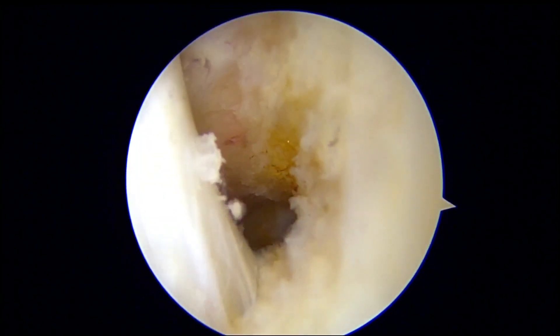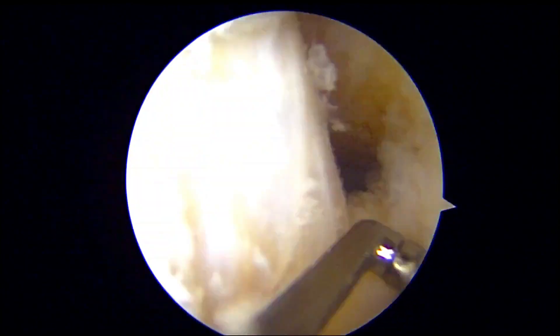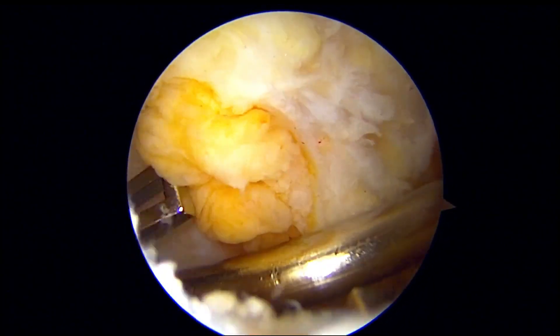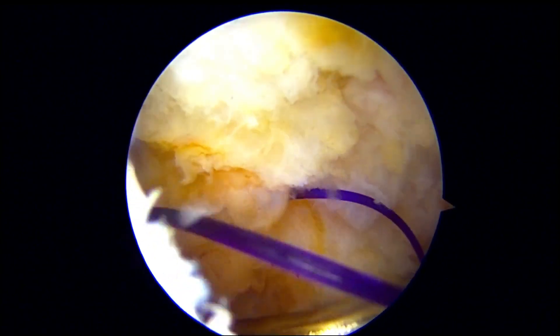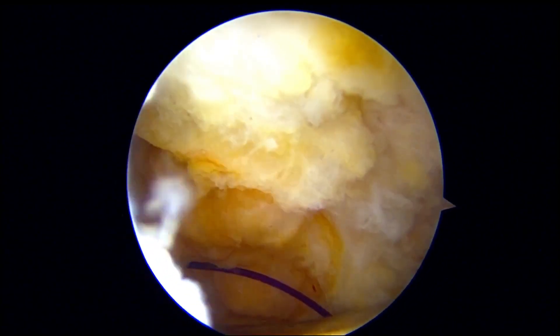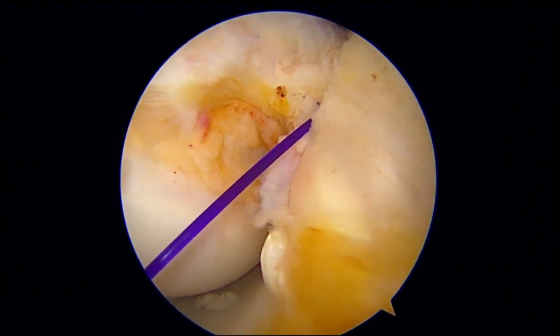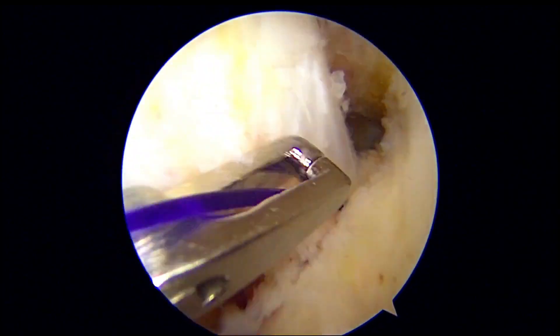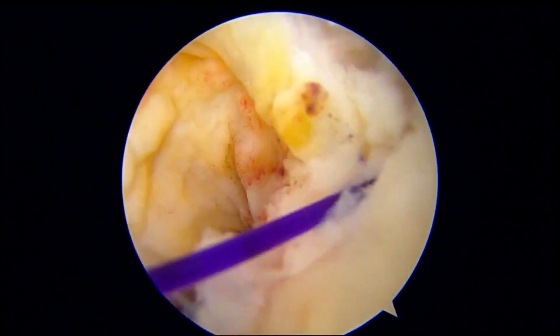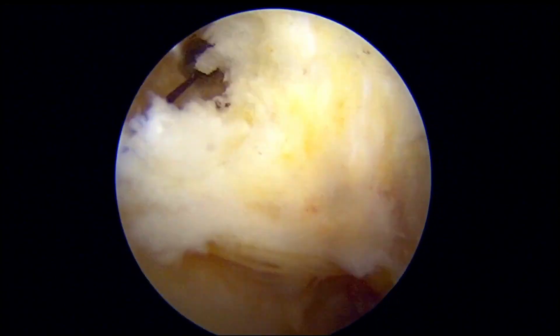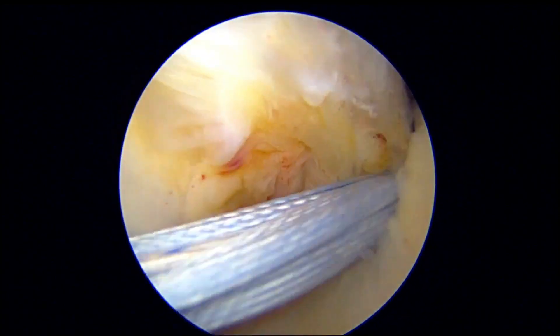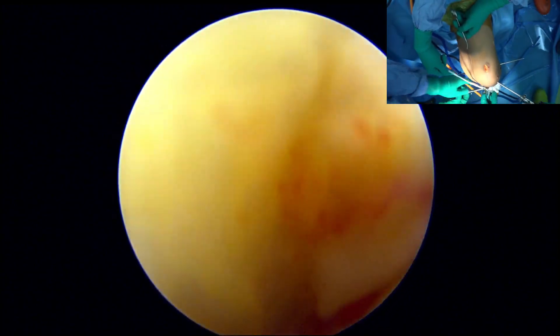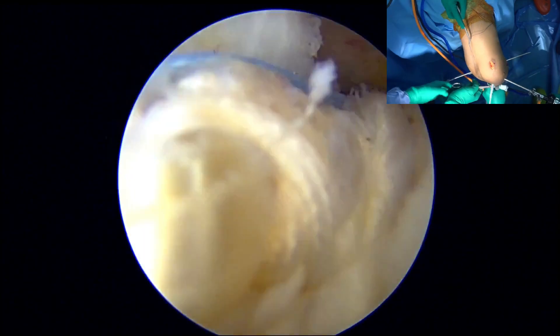The viewing camera was returned to the anterolateral portal. Next, the passing suture for the tibial tunnel is identified through the previously created intercruciate space, ensuring that our graft will be positioned above the remnant PCL rather than below it. Both single limb-passing sutures are then combined and brought out through the anteromedial portal. We will pass the graft using the transportal technique. We recommend using a single limb-passing suture to start, because using a double limb can sometimes cause the loops to cross each other, making it difficult to pass the graft. We start by passing the graft towards the tibia first. The double limb-passing suture is passed through, followed by the passing suture and button from the graft. We use the roll and pulley technique, which we find to be the most suitable and easiest method to pull the graft towards the tibia without damaging it.